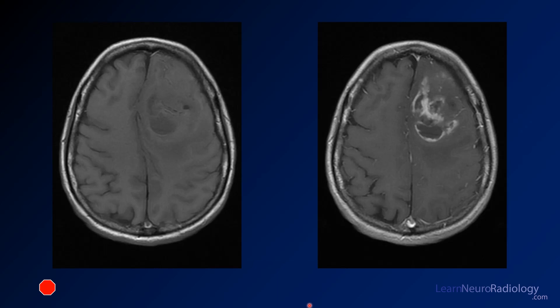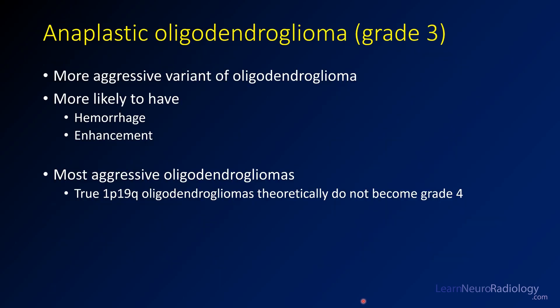On pre- and post-contrast imaging, there are some areas that are relatively isointense and other areas that are slightly hypointense. Unlike the previous tumor, on post-contrast imaging you have avid enhancement of portions of this tumor — centrally, around the rim of some of those cavities, and very jagged, ill-defined but avid enhancement. There is a lot of enhancement in this tumor, suggesting it is probably a higher-grade lesion than the previous oligodendroglioma.